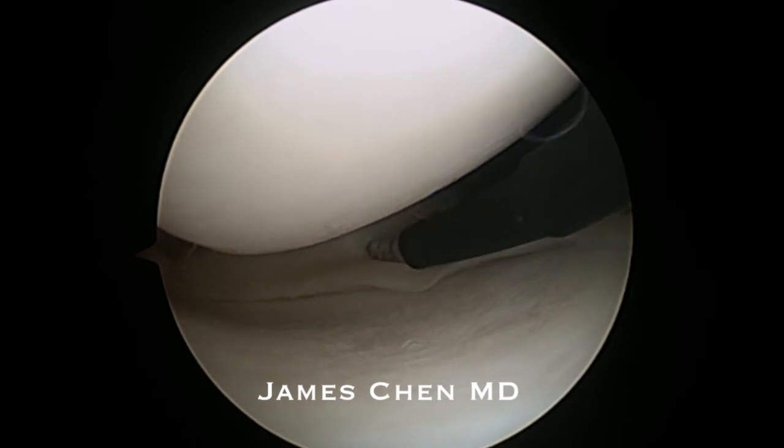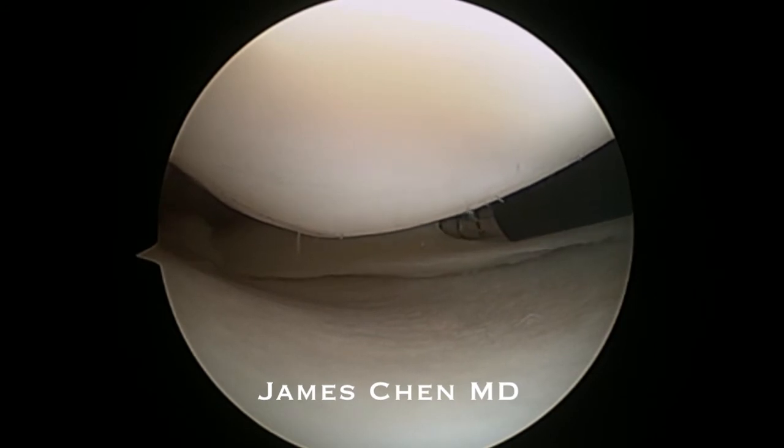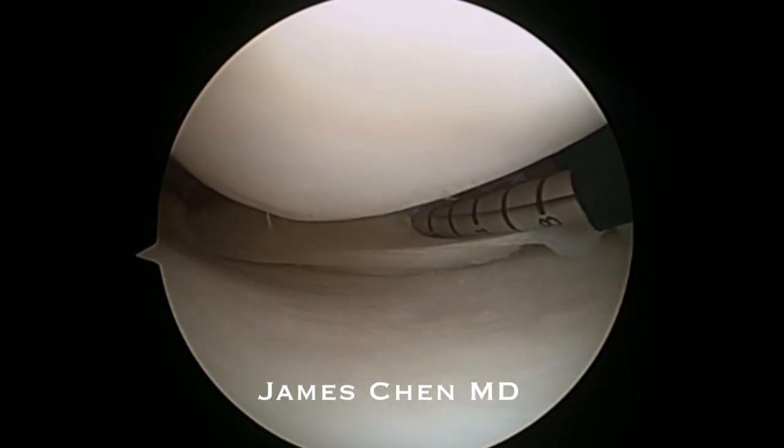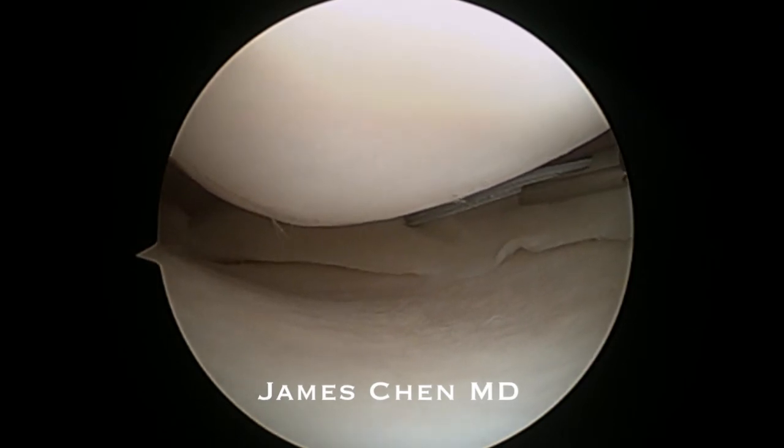I have inserted the Speed Cinch from Arthrex and I am puncturing one hole through, deploying a small anchor that goes behind the joint capsule. Here I am withdrawing it and then reloading.